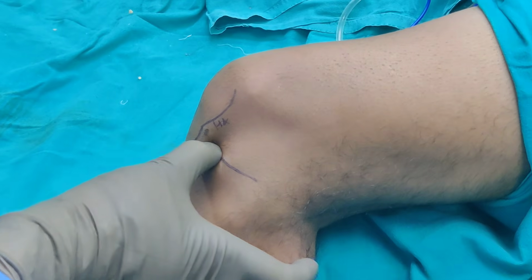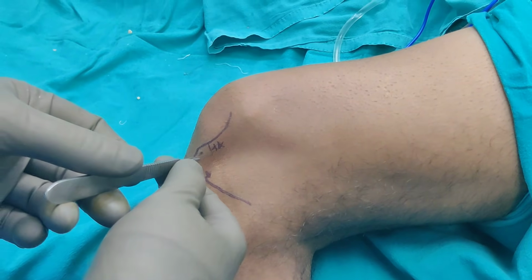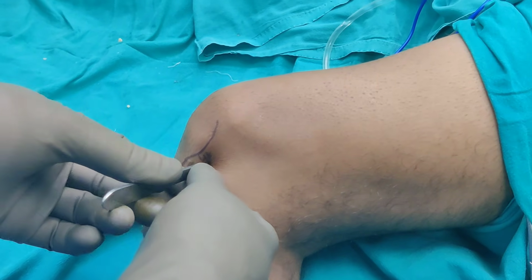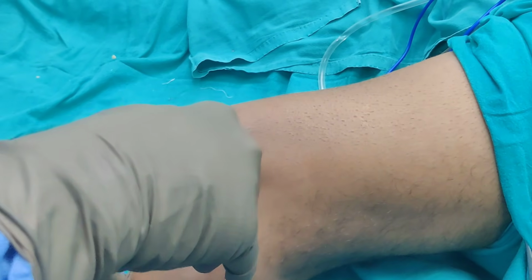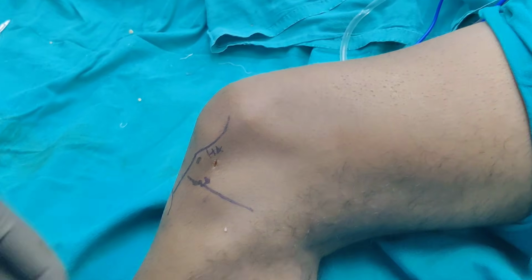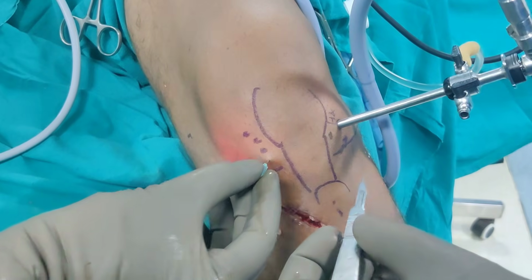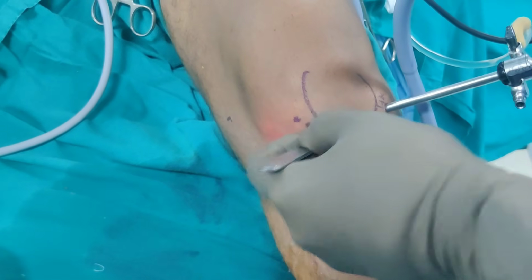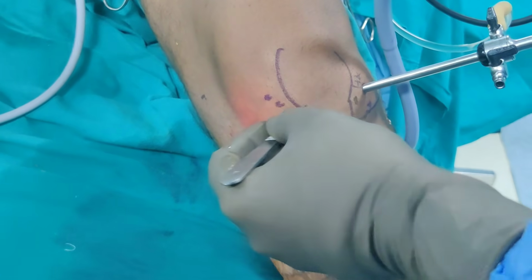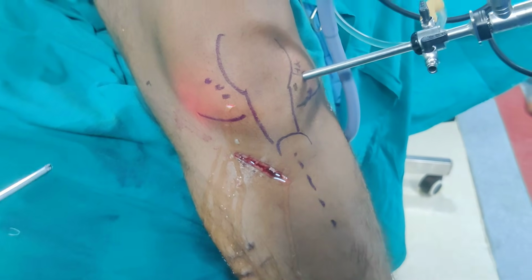So normally my portal will be somewhere here. I am going high anterolaterally. So this is my anterolateral portal. I am going at an angle of 45 degrees, and I would recommend you watch my basic arthroscopy video. Let me go inside the joint and then I will join you. So now I am in the joint. My second portal is this high anteromedial portal. I have gone inside, and then I will put my shaver inside and I will join you.